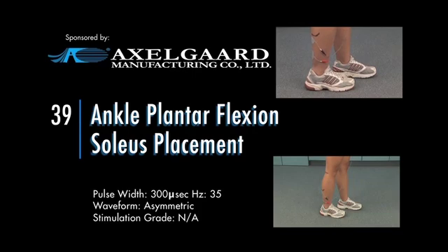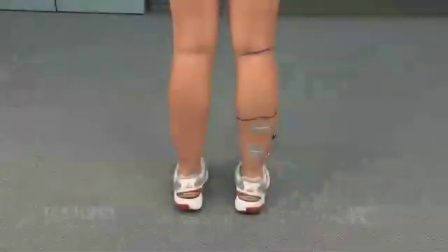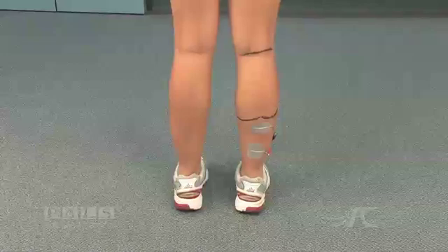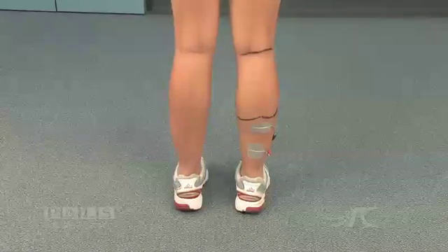Ankle plantar flexion, soleus placement. Electrode placement for plantar flexion stimulation, soleus activation.